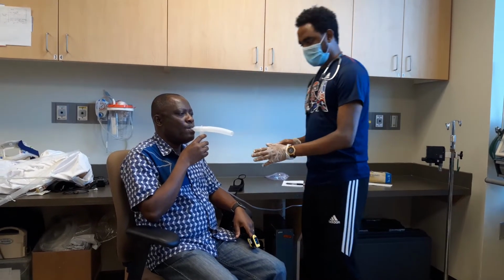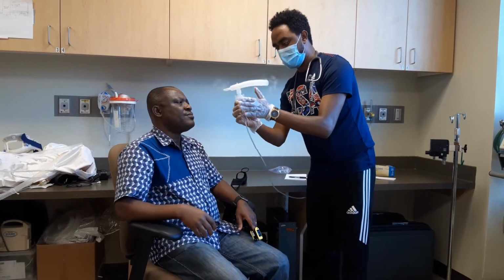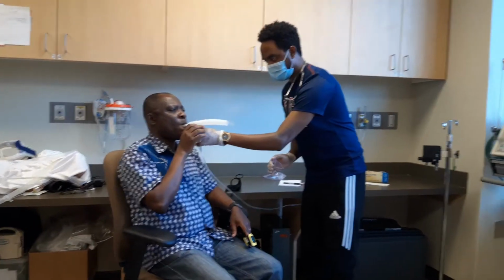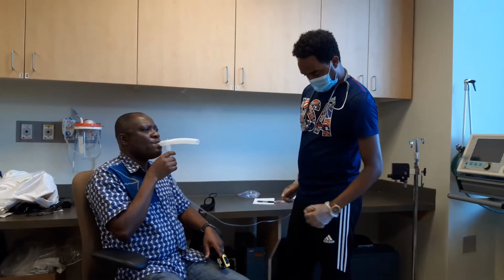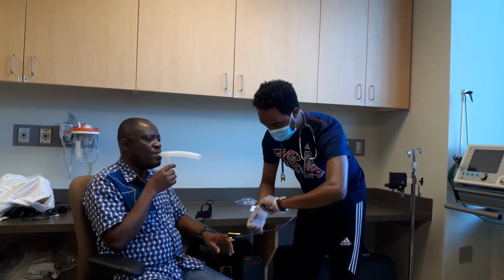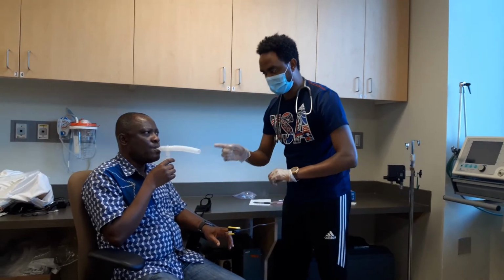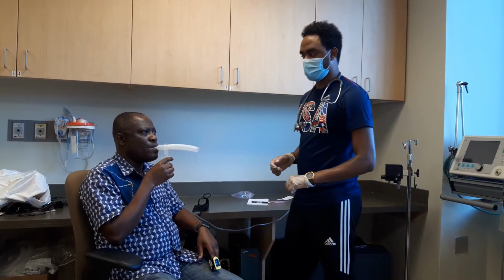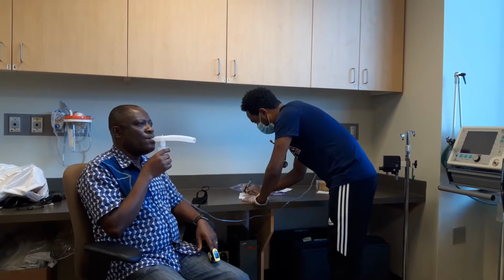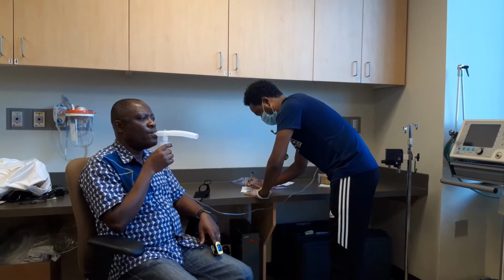Okay. I'm going to tap the nebulizer, because some of the medication is residue in the bottom. Alright, after 5 minutes, the heart rate has not increased more than 20%, so I'm going to continue the procedure, and it will continue 15 to 20 minutes.